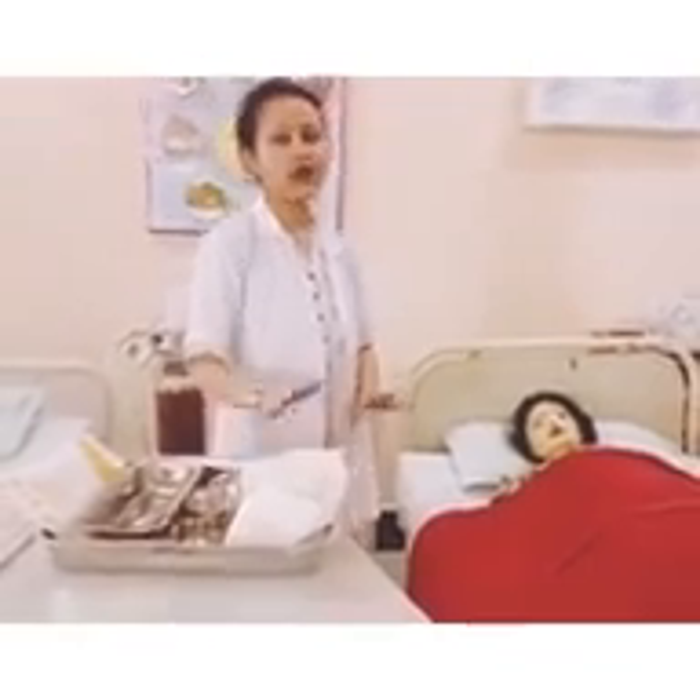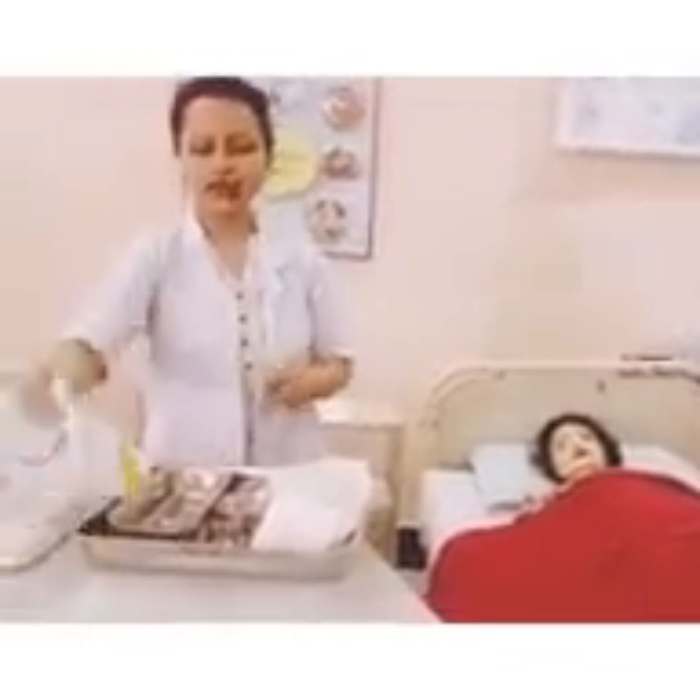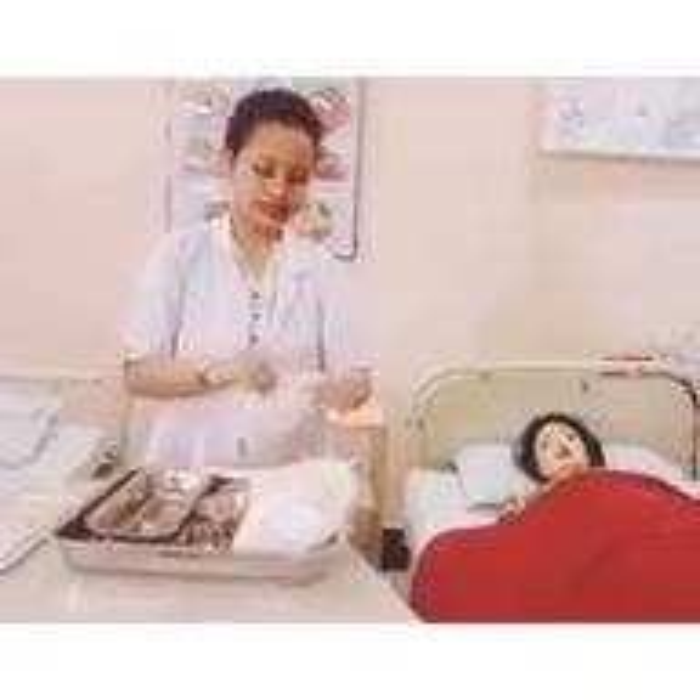Before we start the procedure, I wash my hands. After washing the hands, you have to wear sterile gloves.